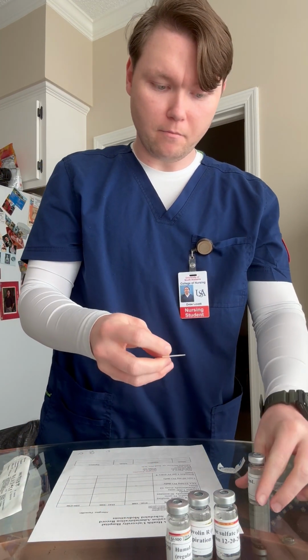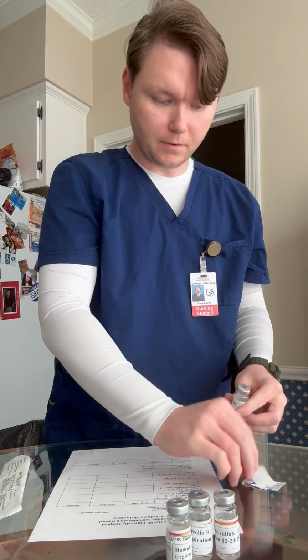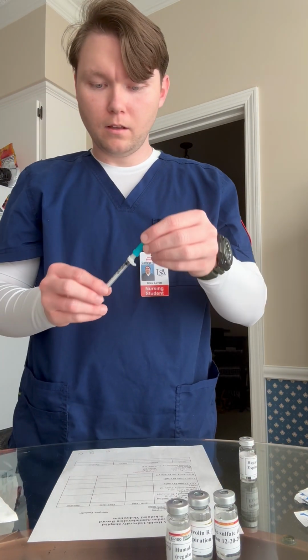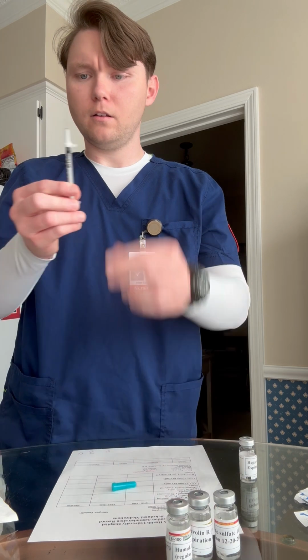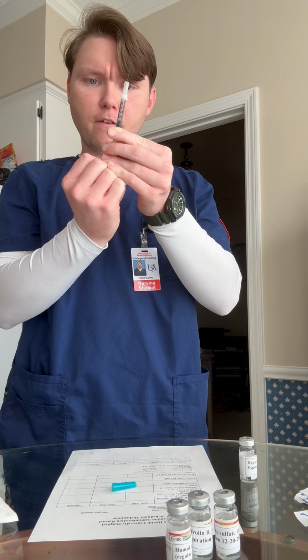And right dose. So hand hygiene. First I'm gonna clean my vial. Clean. All right. I'm gonna draw up 0.5 milliliters. So there's 10,000 units per milliliter, and my order's for 5,000 units, so I need 0.5 milliliters in order to get 5,000 units.